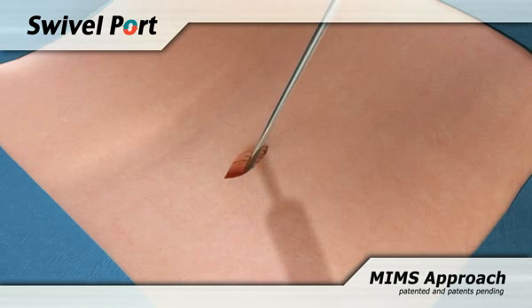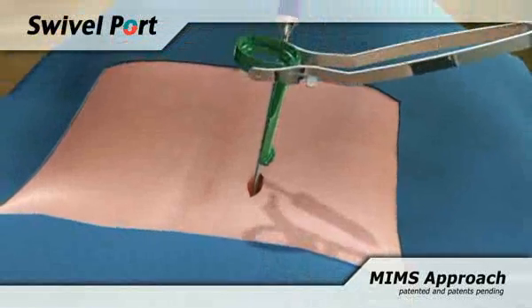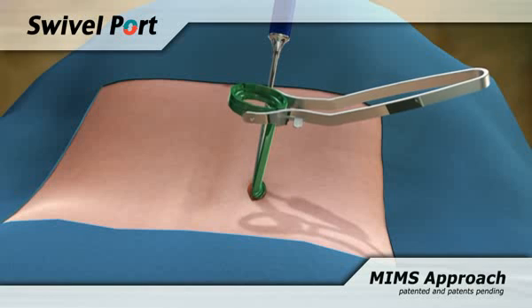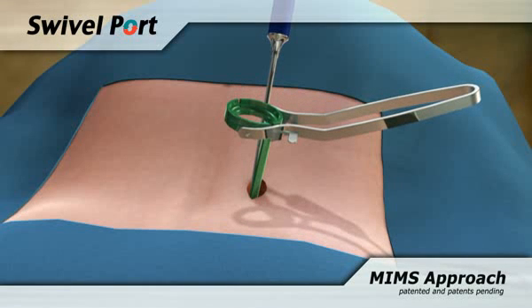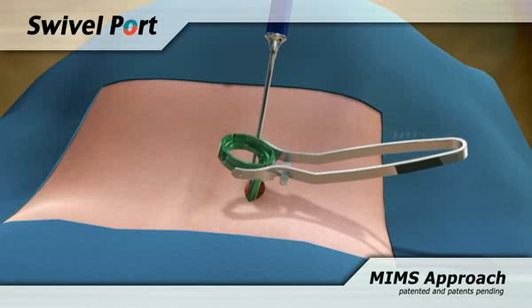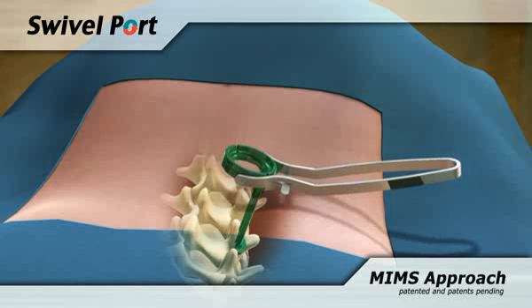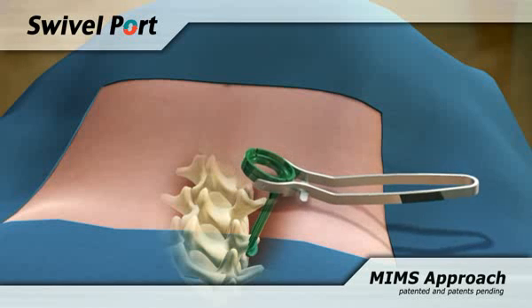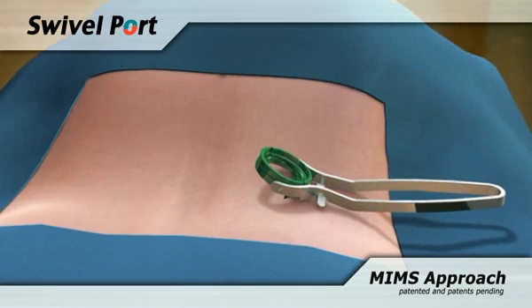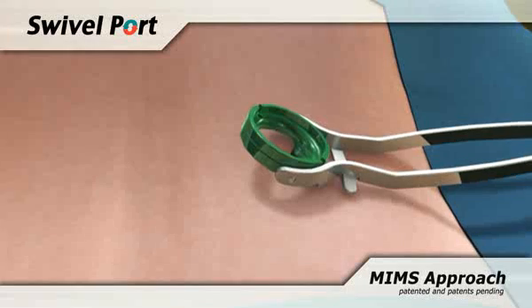Retraction: Attach the handle to the closed swivel port base, with the flanged blades pointing towards the surgeon. Slide the closed blades into the wound through the muscle splitting incision, using a Cobb Elevator to guide the port and to keep the incision open until the port rests on the bone. Gently retract the muscle laterally, hooking the flanged ended blade into the tissue for optimal stabilization and keeping the port firmly resting against the bone. Confirm the position with fluoroscopic imaging.